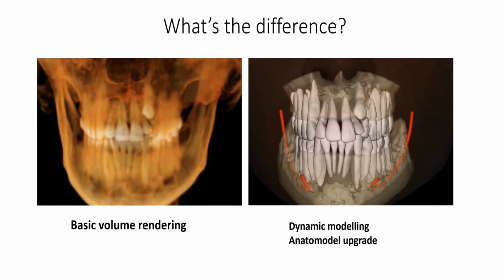Okay, now on a PanRx, you can imagine, is that impacted canine buccal or lingual, right? Yeah, there's the SLOB rule and all that kind of stuff. But keep in mind that could be higher radiation depending on the settings, right? So why would you not want to do this if it gives you better diagnostic information at a lower radiation cost? And if you could do an in vivo model with segmentation, it's kind of a no-brainer.